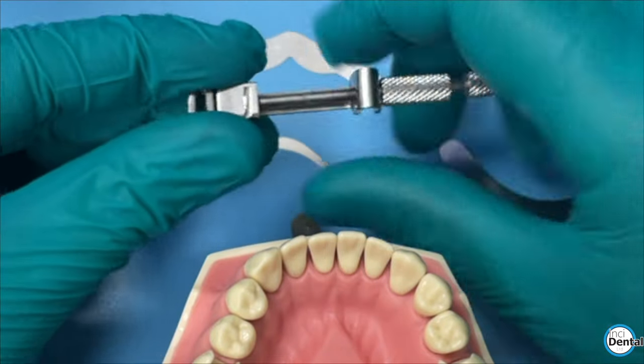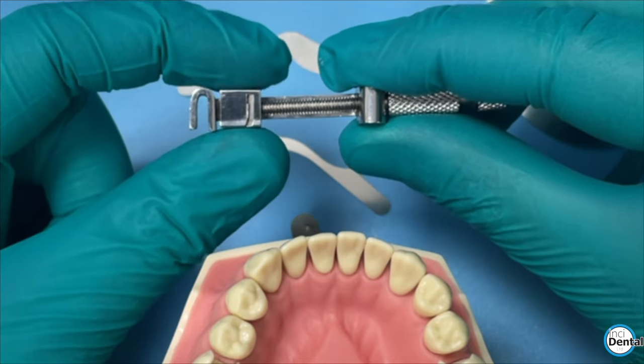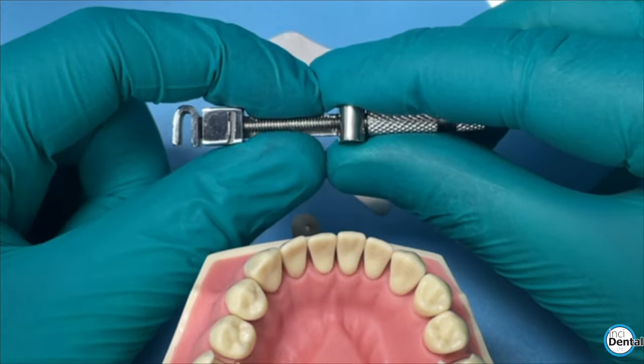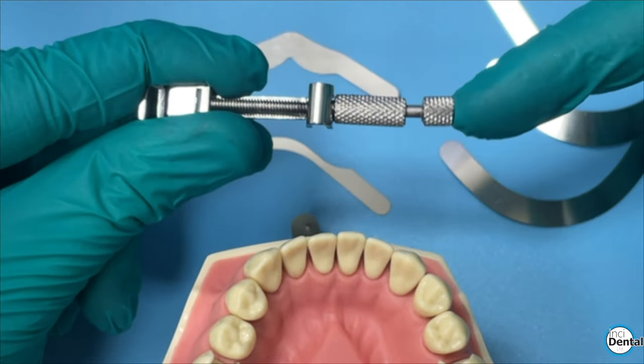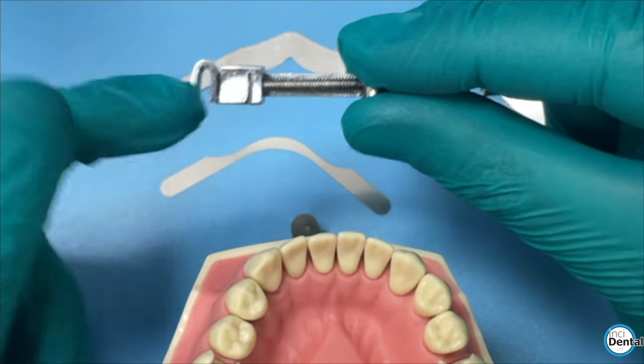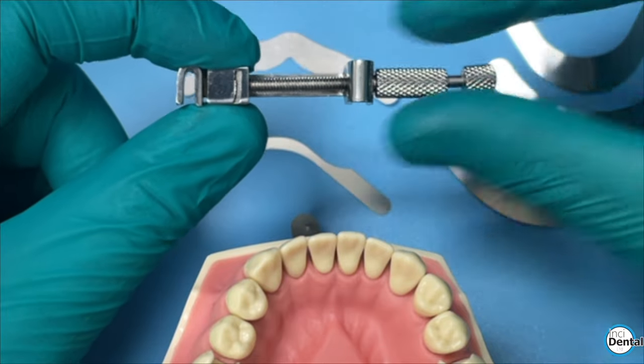Let's talk through this matrix retainer. You've got the U, which is where the matrix sits. You've got the chuck, which goes up and down and actually tightens the retainer when it's in place. And then you've got the back square. The back square goes all the way through the Toffermeyer and secures the band to the chuck. That's the first step - secure the band to the chuck, and then tighten the chuck.